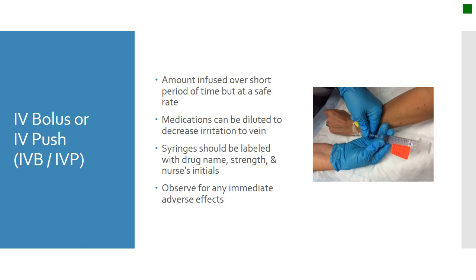And once you administer an IV push or bolus, it will be important for the nurse to observe for any immediate adverse effects, because this can be instantaneous. You could not only have an IV bolus or push of a small amount, but also you could have an IV bolus of fluids, such as a large volume like a liter of fluids. This is because that patient needs it rapidly now. So it's not necessarily a small amount, but when it is a small amount, you need to be mindful and always check for adverse effects.